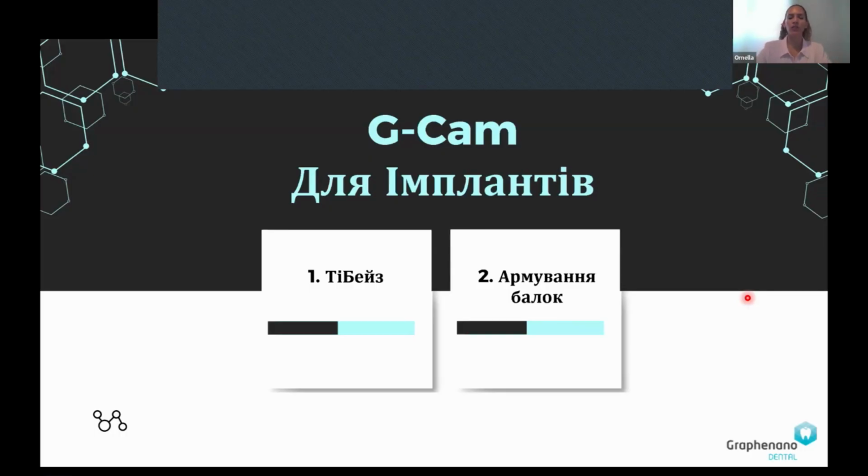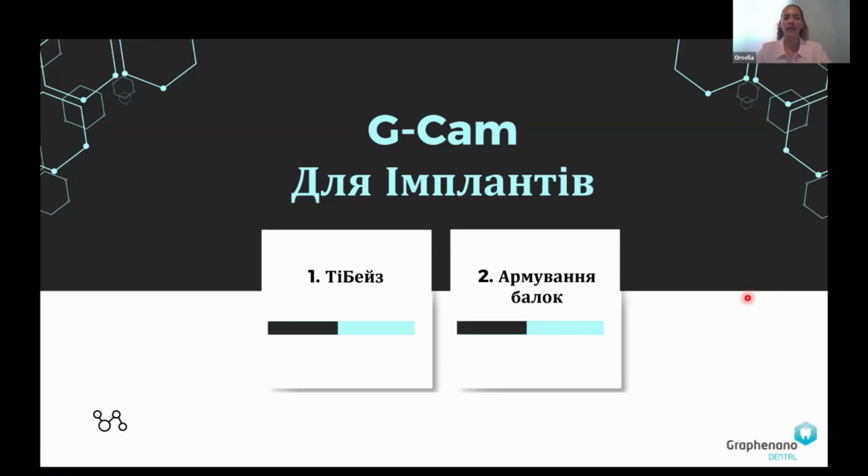I could work using a T-base, that is going to be a cementation process, or I have to reinforce my structure with a metal bar or any reinforcement material in the bottom. Now I'm going to explain when it's possible to work with one option or the second option.